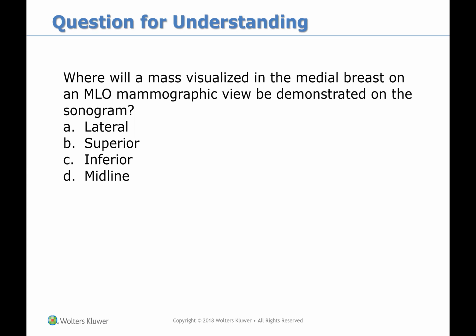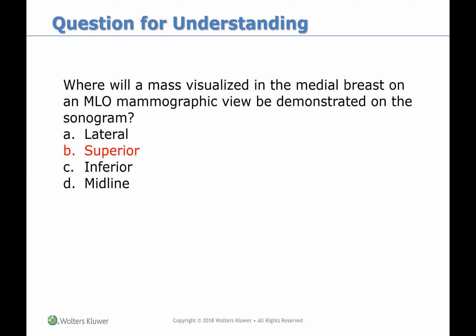So if it's in the medial breast on an MLO, I think, let's see what they say. Superior. Yeah, I'm not sure on that one. I'm not very good at reading mammograms. That's why you need your mammo tech to help you. Or if you become a breast sonographer, then you will know how to do this.